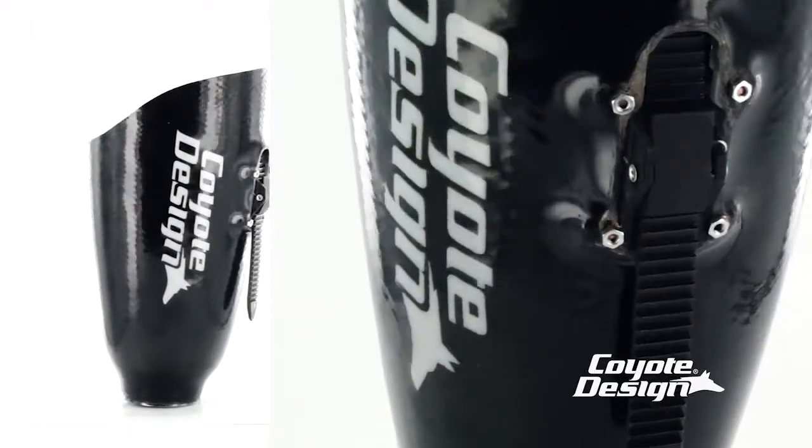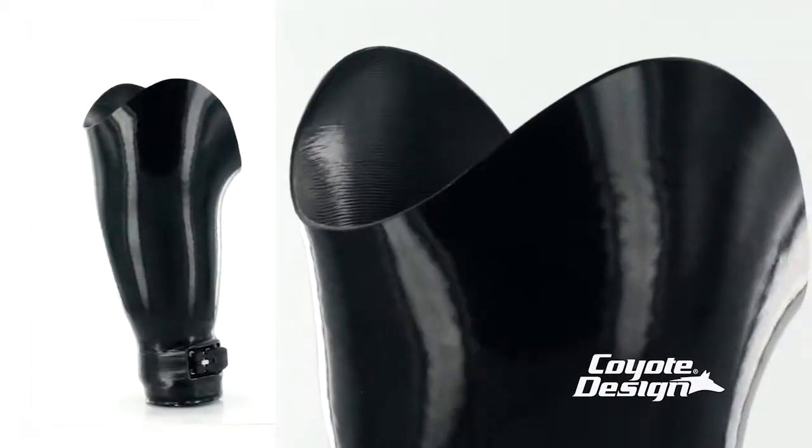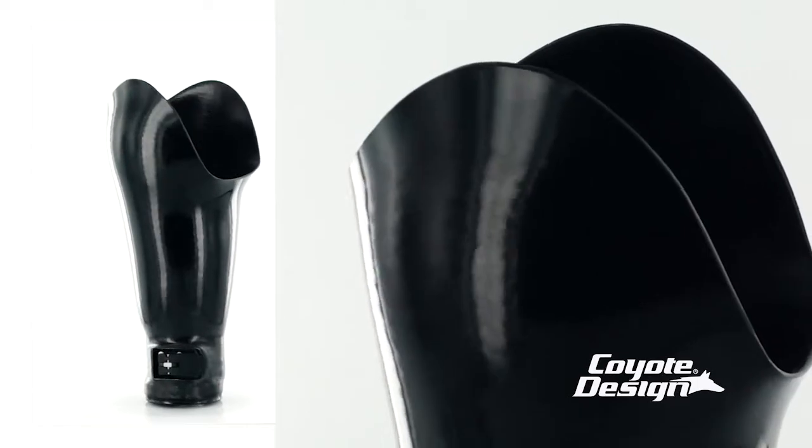In many areas, this material excels over carbon fiber and can be finished easily to have the same high-tech look with smooth edges that take no special attention. This is superior to carbon.